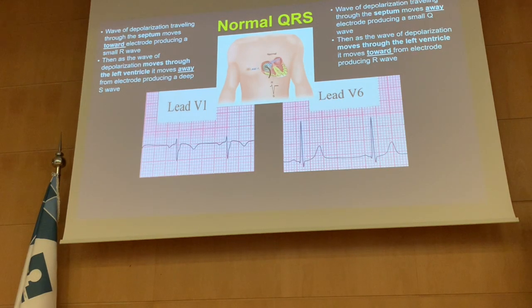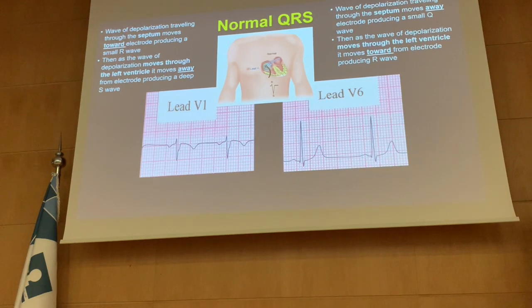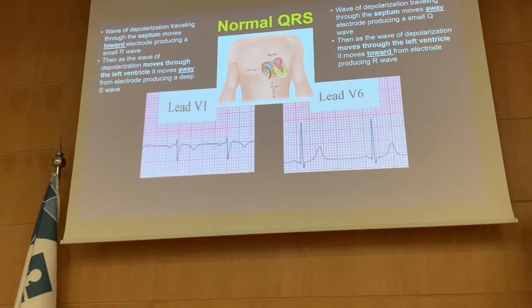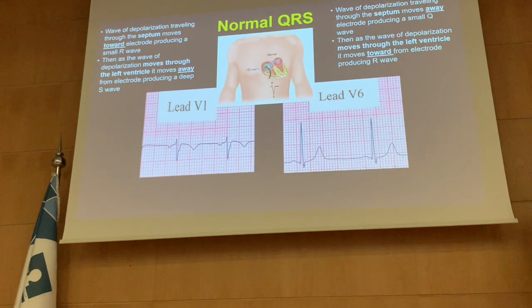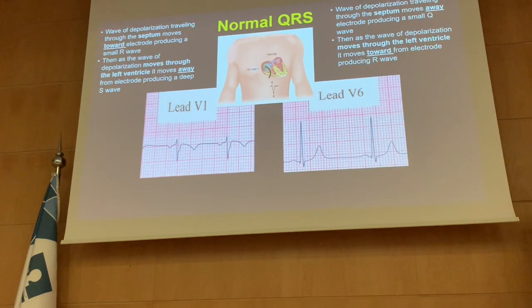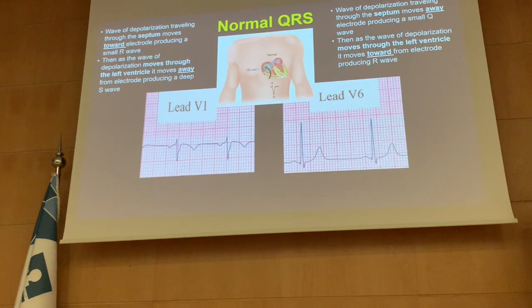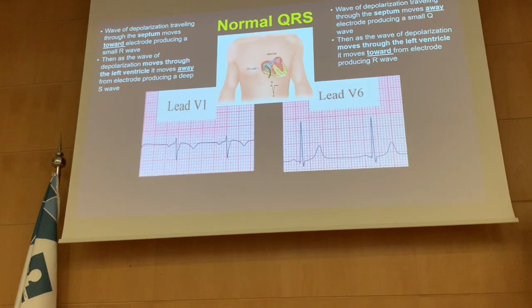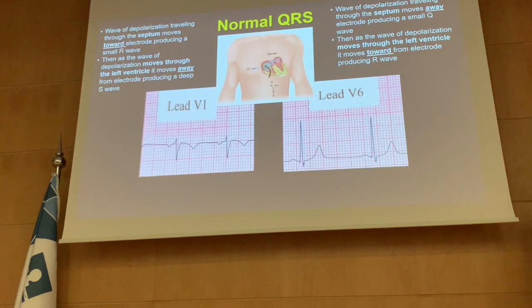So if you have a patient with left ventricular hypertrophy, which part of the ECG are you interested in? Is it the atria, the QRS, or the T wave? QRS, okay. And the QRS will be wide or tall? Why? Choose one. Tall, because the amplitude should increase. It must be tall only. Wide means dilated ventricle. Wide means a very diseased ventricle.